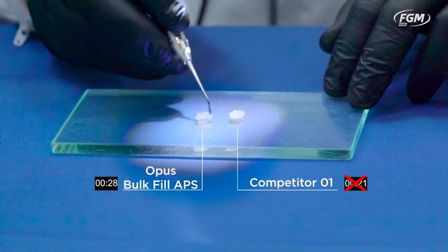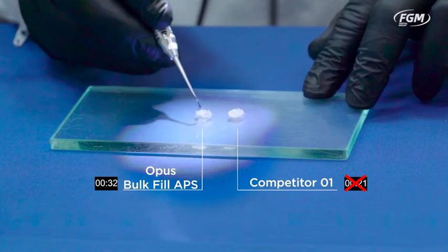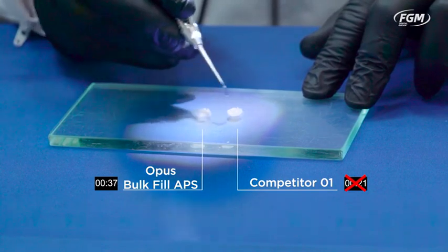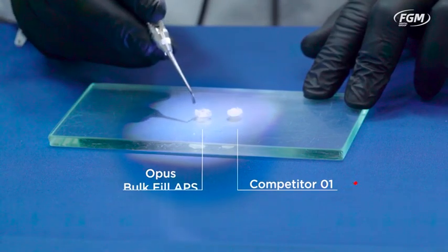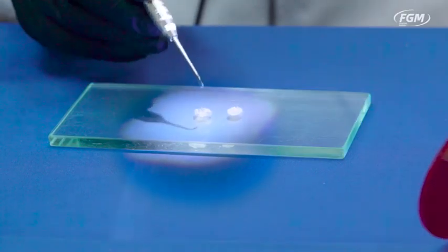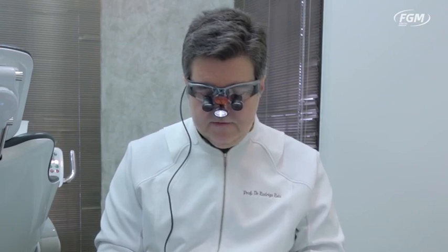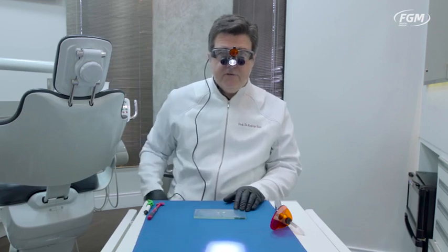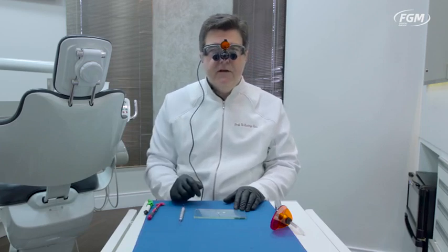So you have a little extra time under a well-illuminated operatory field to remove the excess when you're carving your bulk fill composite. See — this one is hard, while this one still has a little bit of plasticity, even under a strong setting of the loop light. This can be dimmed to a low intensity for even more working time. This is a clear advantage for those who like to work with packables — APS technology will give you extra working time.